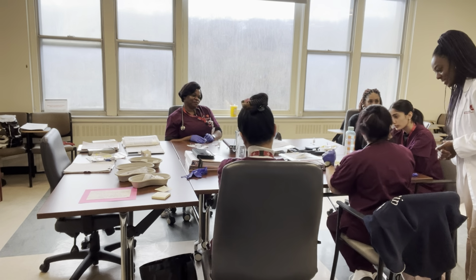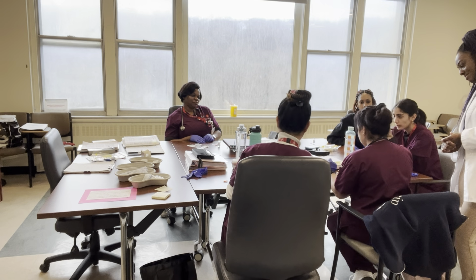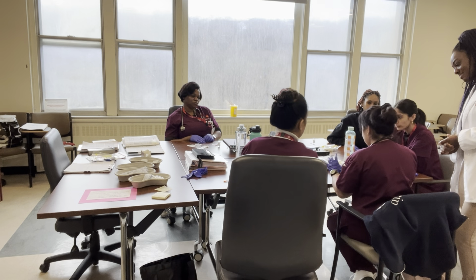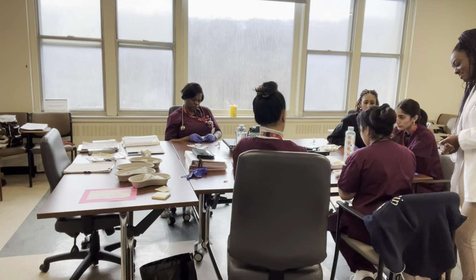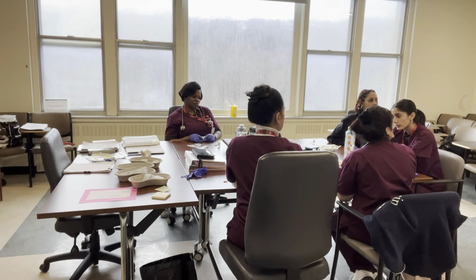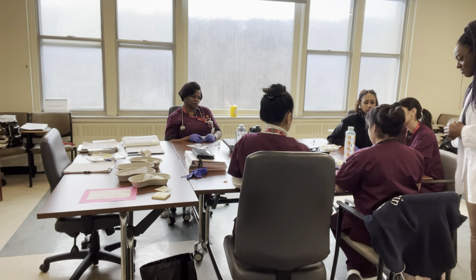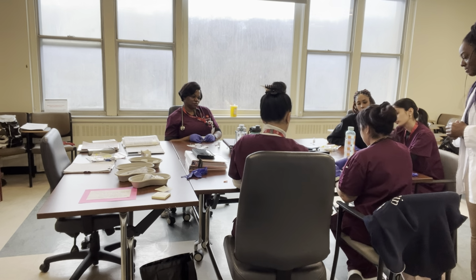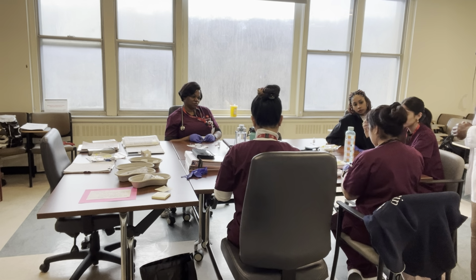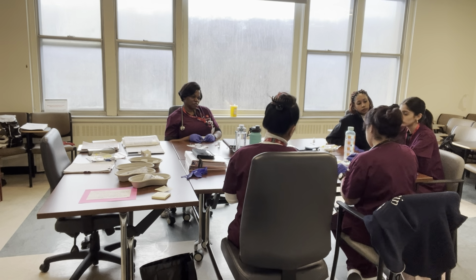Okay. So I'm gonna check the blood, check if you have the sharp container, and then check the settings. So Mrs. N, my name is Sherry, I'm next to our teacher. So you guys, sorry, you don't have to give me the whole background and pretend like you're talking to the patient. That's correct. And then you're going to do what? I'm gonna ask the patient to lift the shirt.